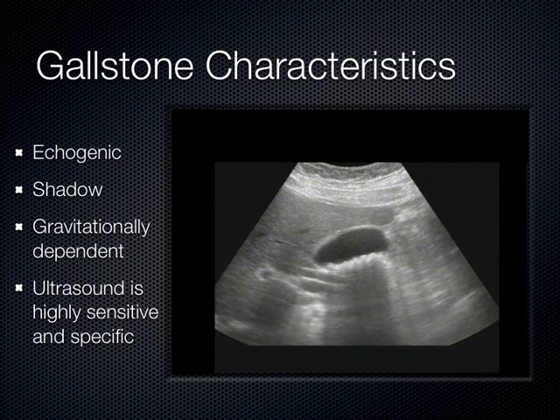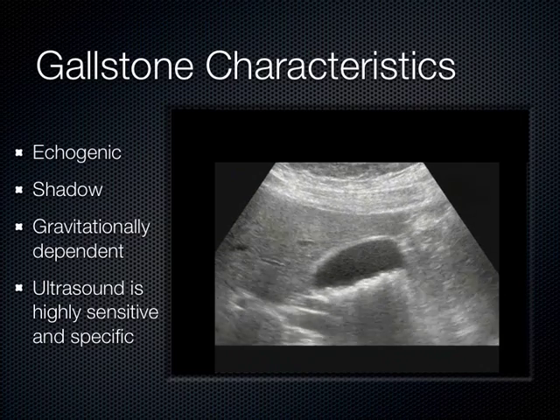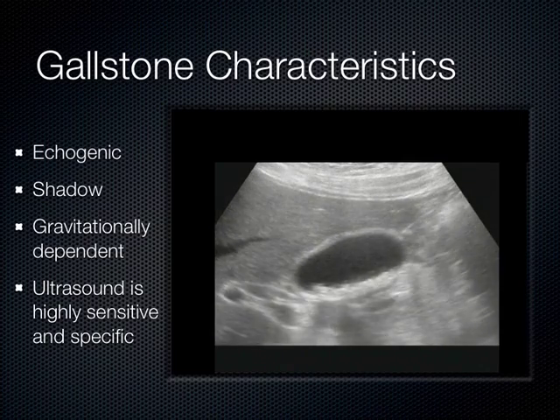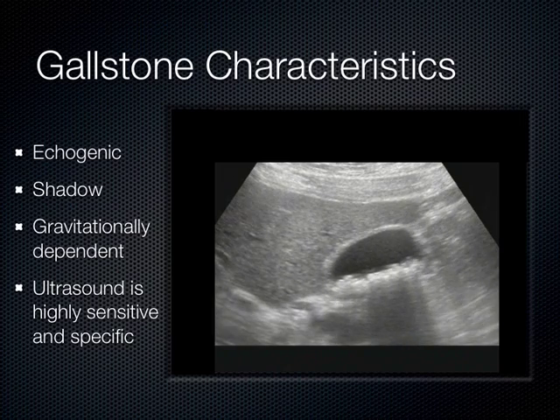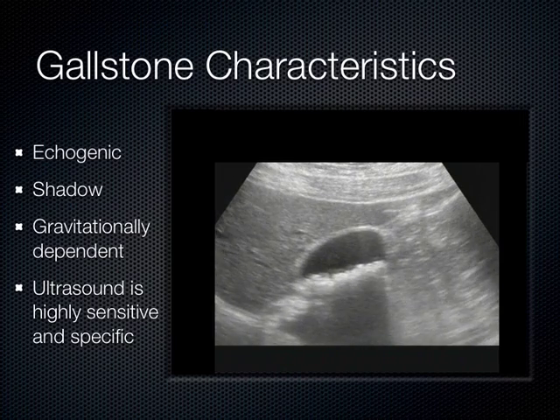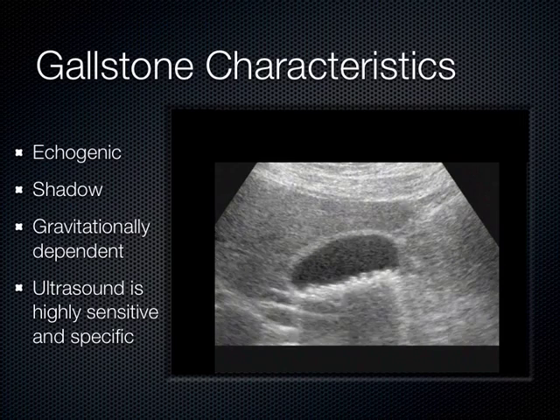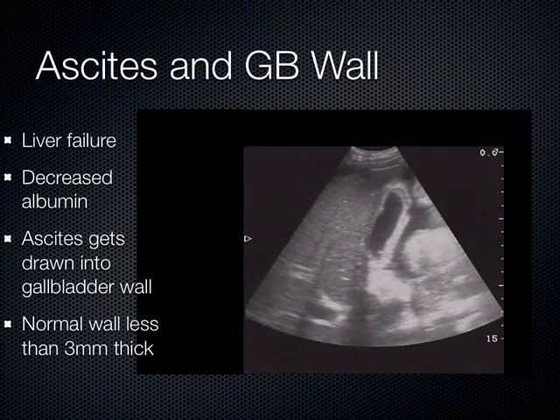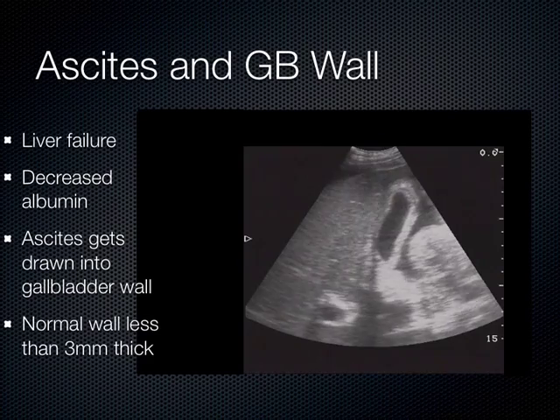It beats out CAT scan because with a CAT scan, you can miss the gallstone on that one little cut. And I've got plenty of examples of that from the literature and anecdotally, where ultrasound found stuff that the CAT scan missed, especially when it comes to gallstones. And this is just another example here of the gallbladder wall.